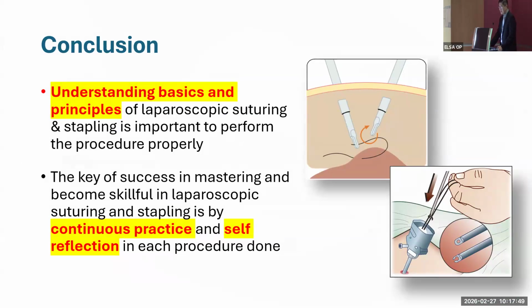So understanding the basics and principles for laparoscopic suturing and stapling is important to perform the procedure properly. However, the key to success is continuous practice and also self-reflection on each procedure.